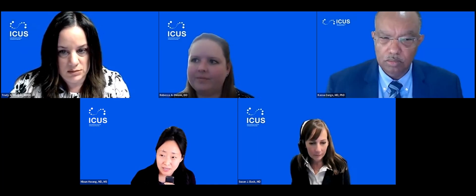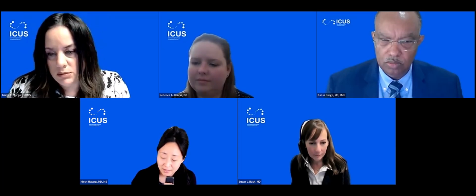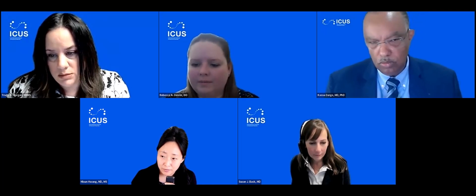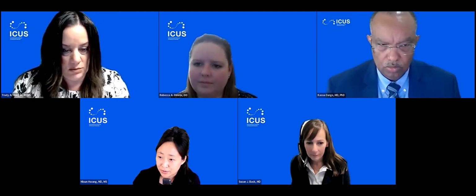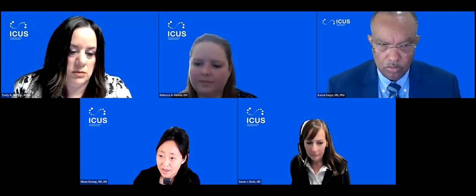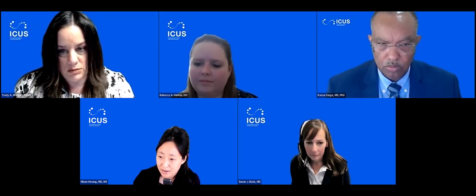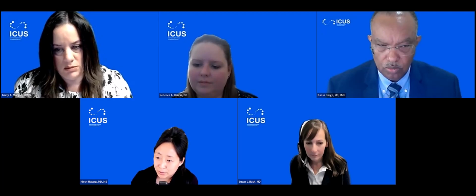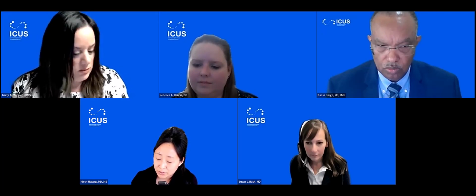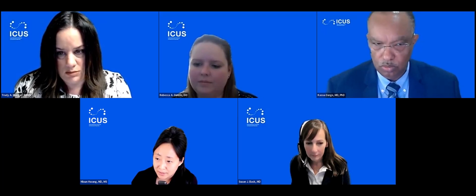Can you hear me? Yes. If I can chime in, I think that even in the case of tumor and you have background hepatic disease, hopefully the enhancement pattern of the tumor will be different from the chronic changes and associated perfusion of the hepatic parenchyma. And in the setting of adult hepatic tumors, there are clear guidelines about the washout patterns specific to tumors. And I would assume that a similar rule would apply to pediatric liver tumors. In terms of modulating tumor flow, if you could expand on what that means. I'm not sure if you're referring to post-interventional, or is this related to tumor therapy? Yeah, not sure about what that means.